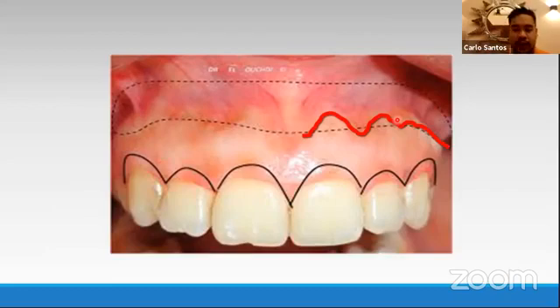My mentor actually called it surgical grace. When you do your surgery, it's like dancing. The first time dancers, you'll see them dancing awkwardly and without finesse. So you practice it in slow motion. You incise with a slow, continuous stroke. Also, your injection should be slow and steady. The secret in suturing is also slow motion movement. For you to be fast, do it in slow motion. Ironically, that's the secret.